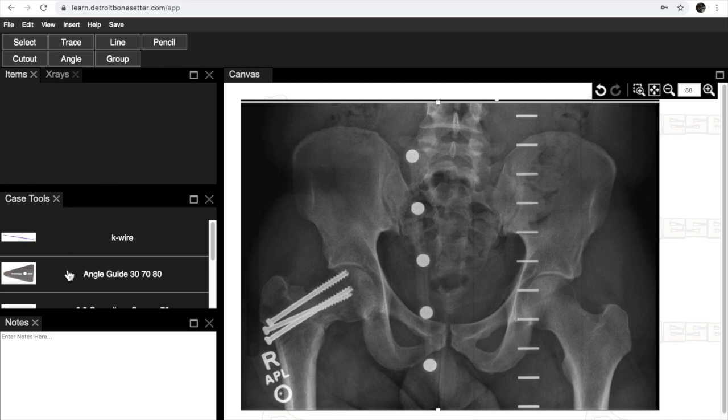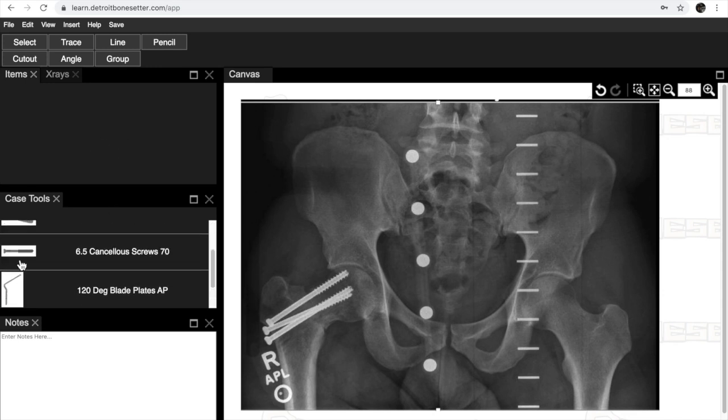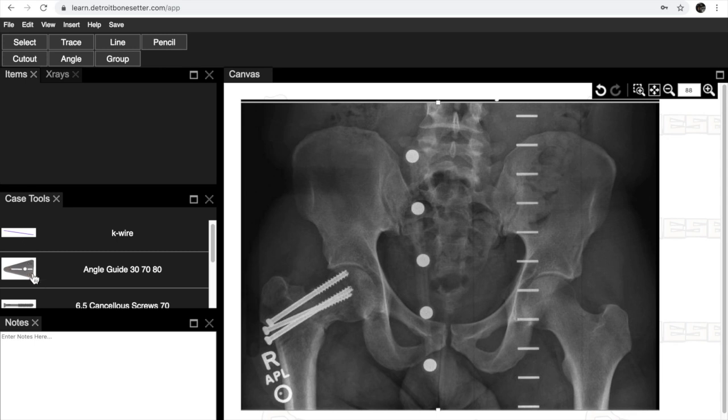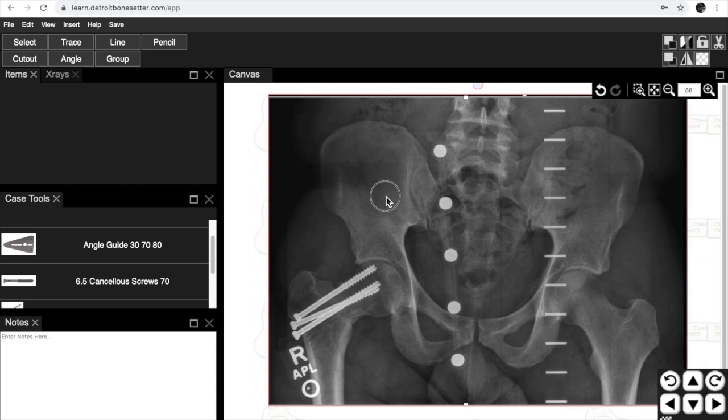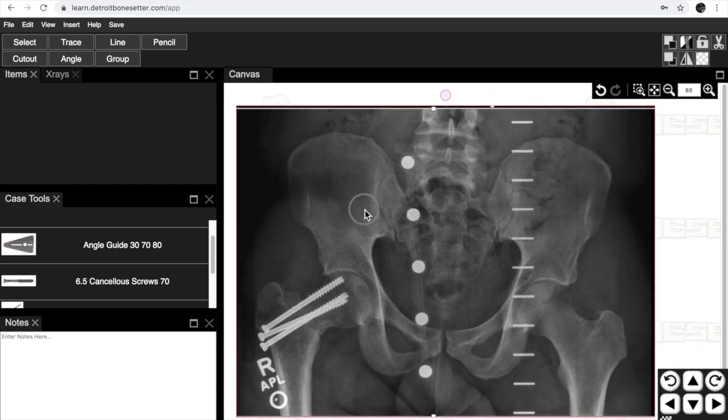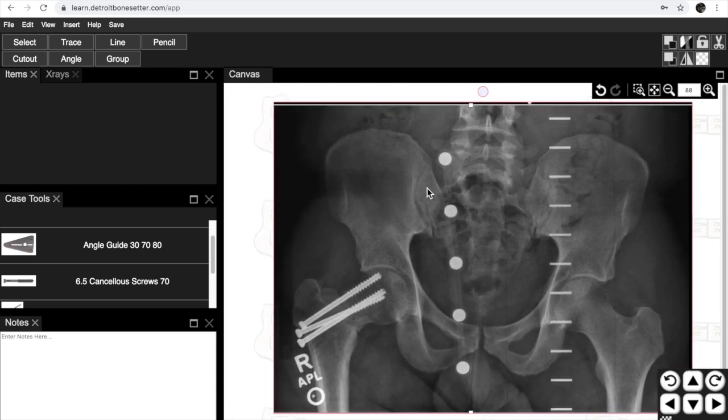These are some case tools that you need like a blade plate, screws, and an angle guide. You can put notes down here. Your x-ray or canvas is here and you can move your x-ray around.